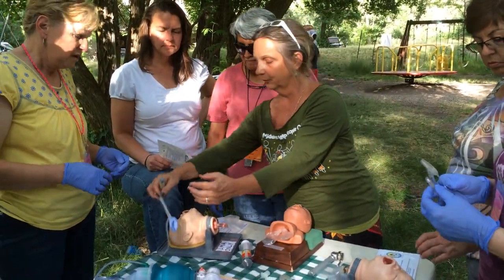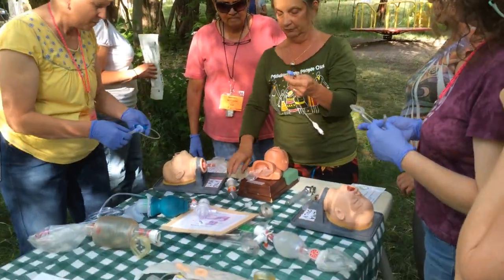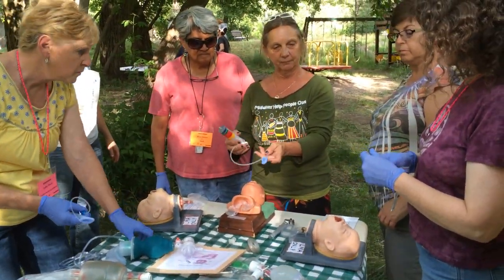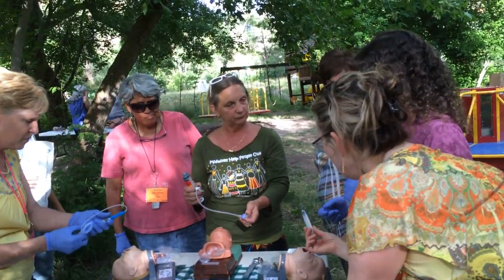All right. So you want to play along with me now, right? So you've got a nice flat laryngeal mask airway. Take all your air out, and then take your syringe off.